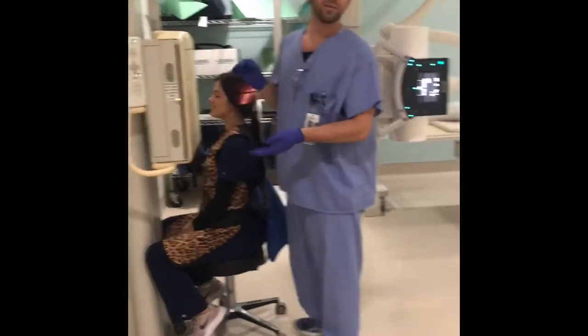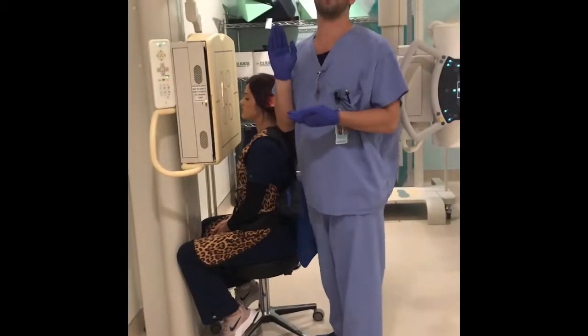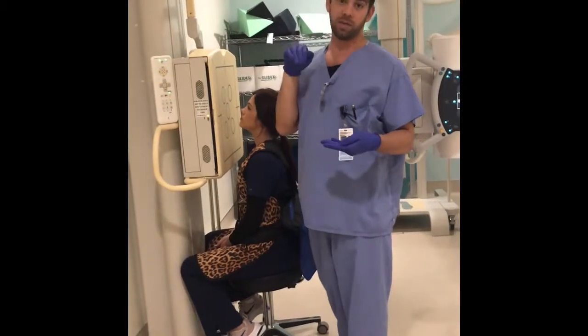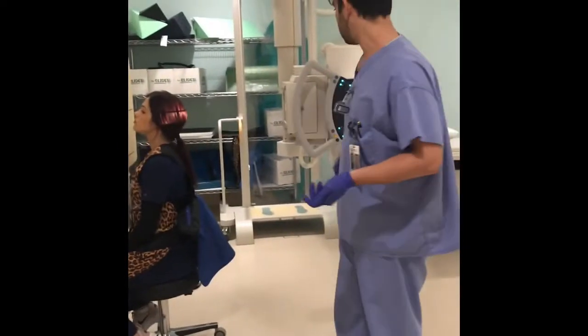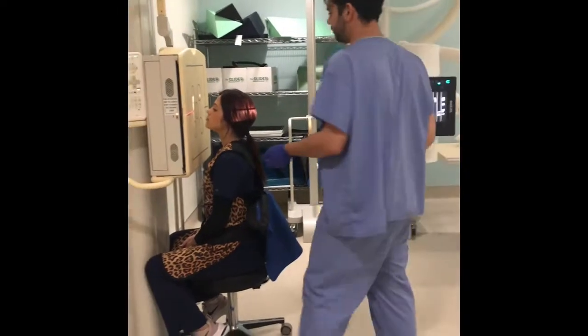So the next one, we're going to have her OML form a 37-degree angle with the IR, so she's going to lift her head up. And another good angle to remember is our MML, our mentomeatal line, is going to be perpendicular with the IR. And like I said, because it's a parietal acanthial projection, our CR is going to exit the acanthion.